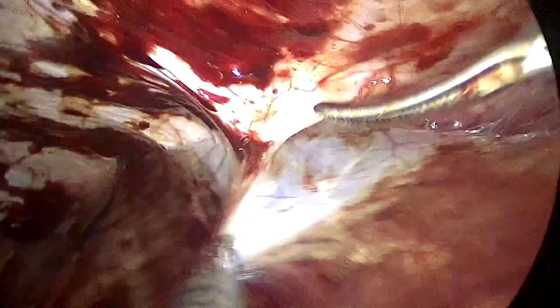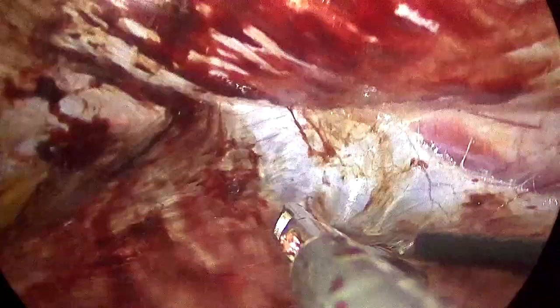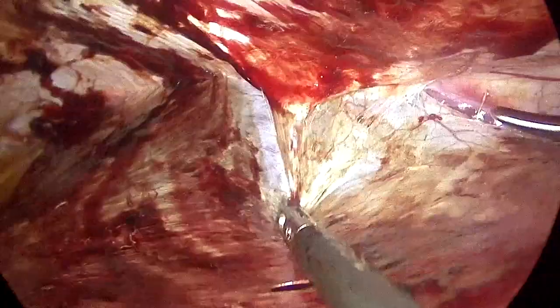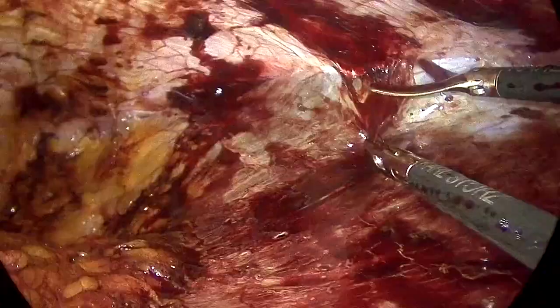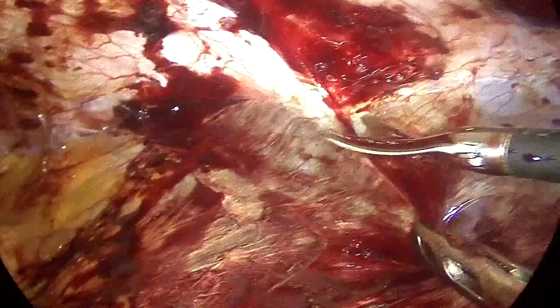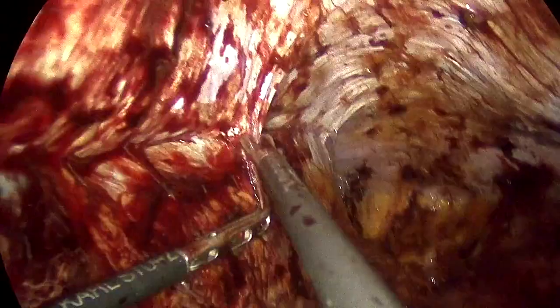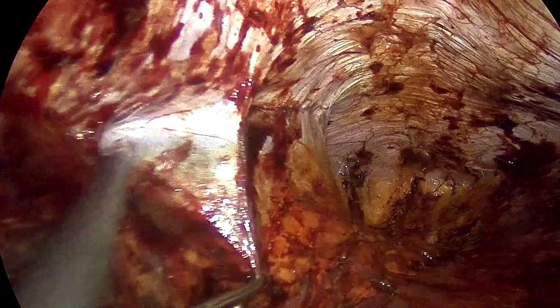By reaching this plane, my job is much easier because now I can create an apex and cut in the center, making my dissection in zone 3 more ample. I stop this dissection when I reach the transversus abdominis. For these kinds of hernias and diastasis, there's no need to go beyond that point, but I am confident I could if needed.